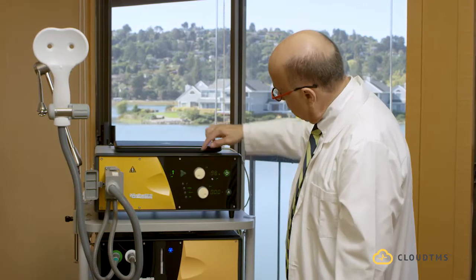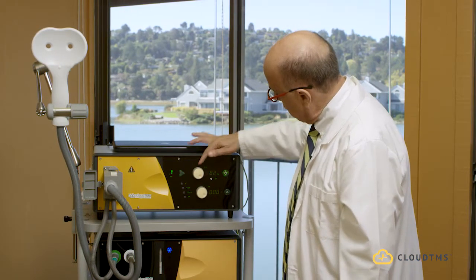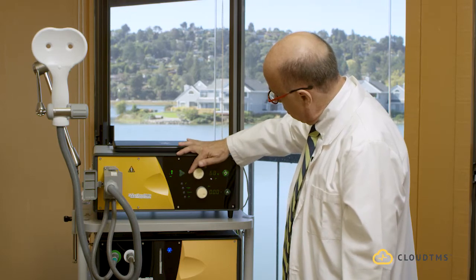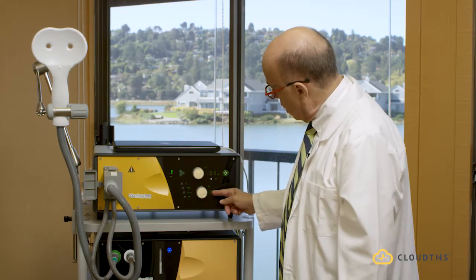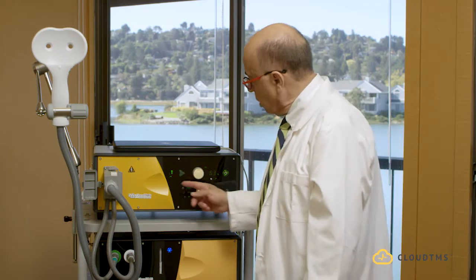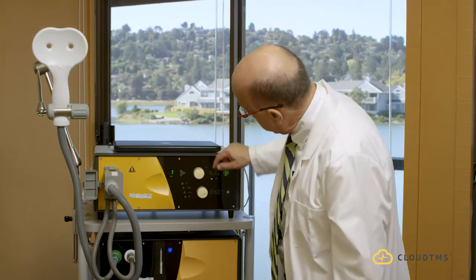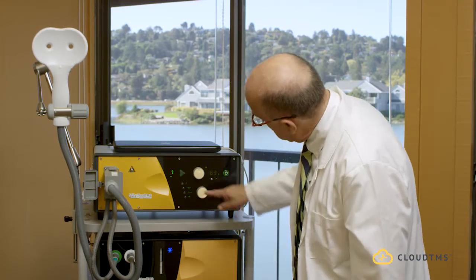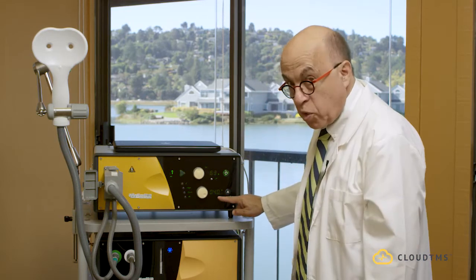What you see here is the dial that sets up the intensity of the stimulation you're going to give to the patient. The settings will change depending on which button you press. Let's first press this button here, which is the frequency button. Whenever I press the frequency button, this displays 4 Hz.